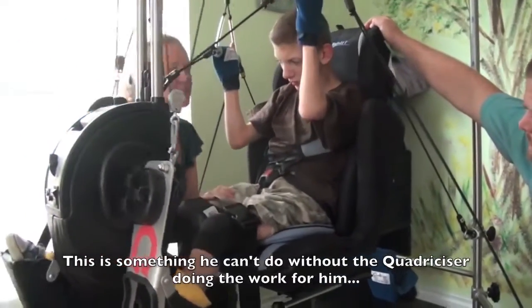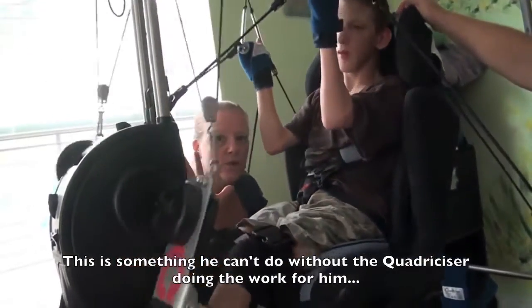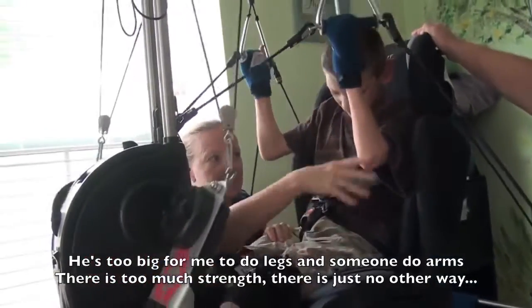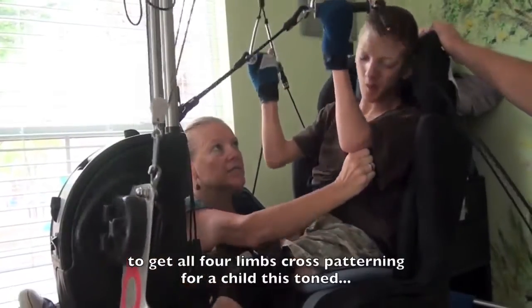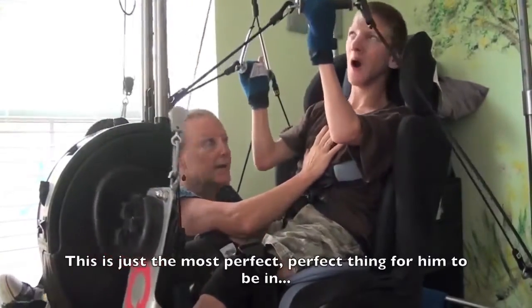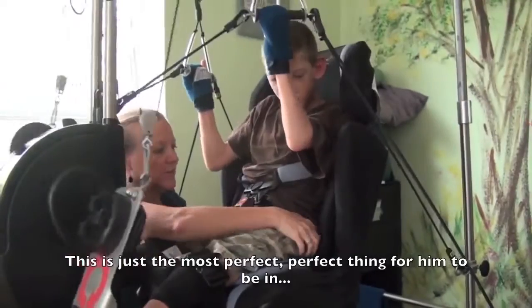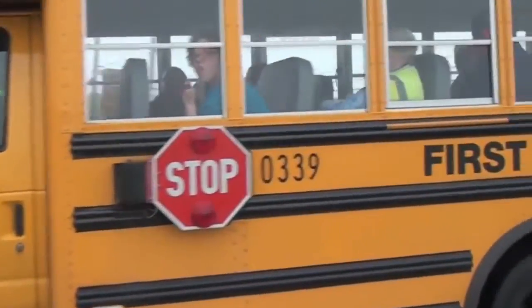This is something he can't do without the quadricizer doing the work for him. He's too big for one person to do legs and another to do arms — there's too much strength involved. There's just no other way to get all four limbs cross-patterning for a child of this age and size. So this is just the most perfect thing to be able to do.